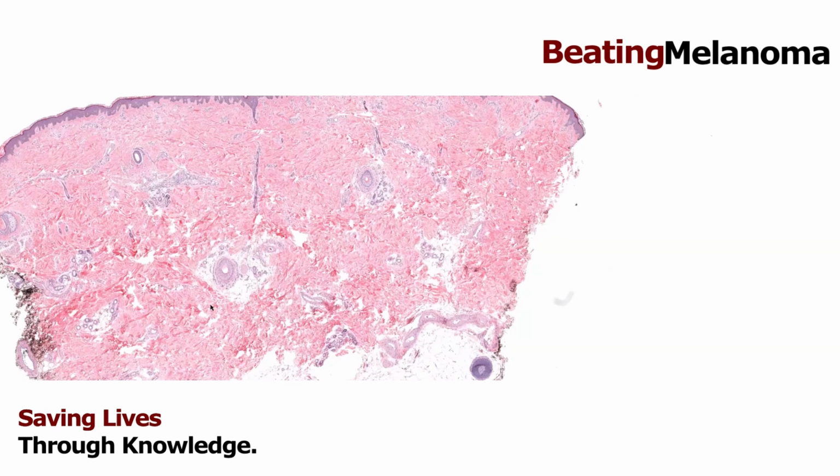All right, perfect. So what we've done here, these were glass slides. This is exactly what I see under the microscope, but we actually have a special machine that's able to scan them and digitize them. And then we can pull them up to show them more easily and with a lot more clarity. So most of the time I don't use the computer to do my actual daily diagnosis, although some pathologists do, and we'll probably see more of that in the future. But I still use my trusty old regular microscope. But for teaching, it works really great to have a digital slide.